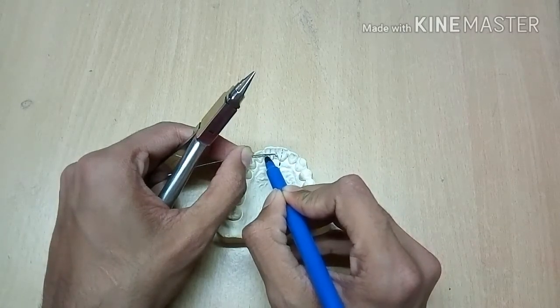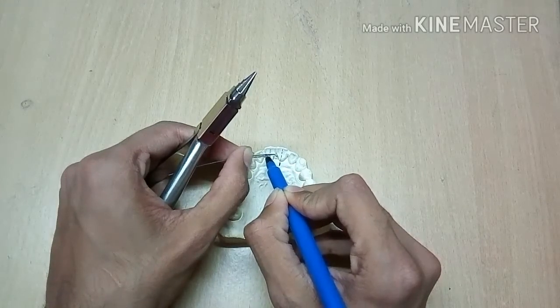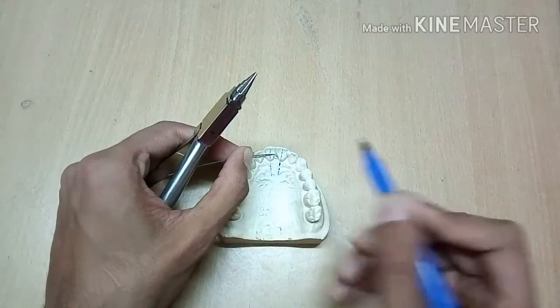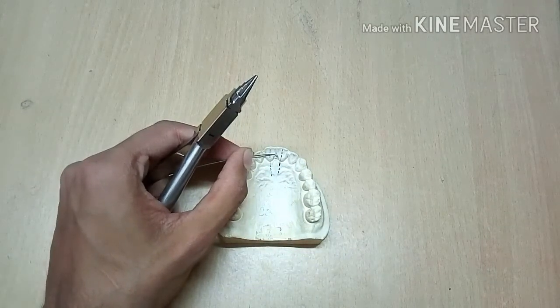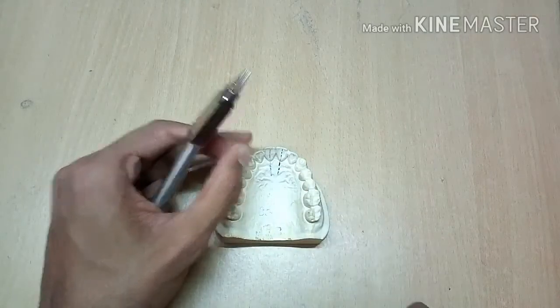The tooth we are working on is tooth 11. We marked the point — always remember the active arm should be towards the tissue.